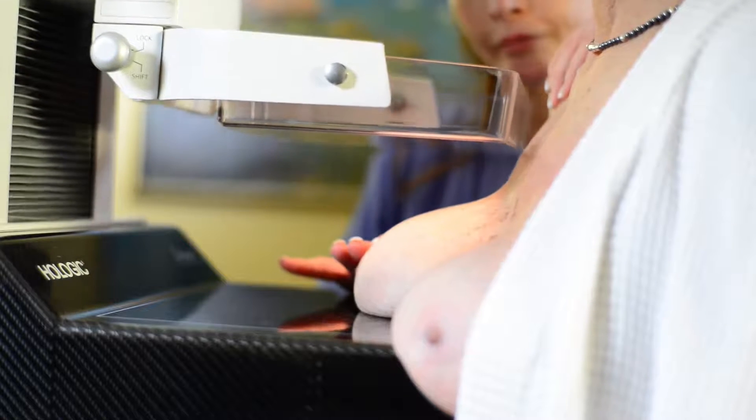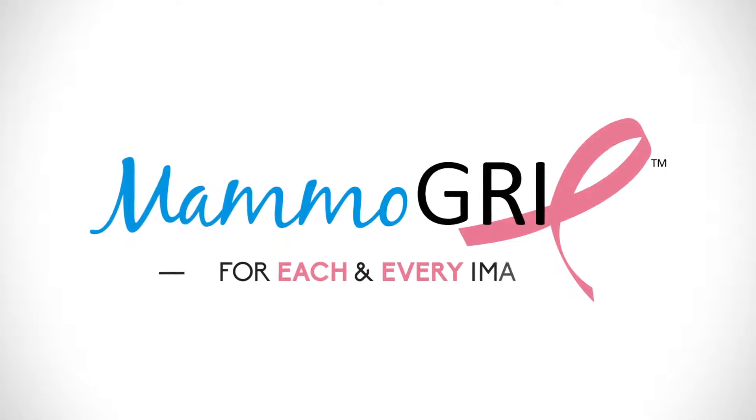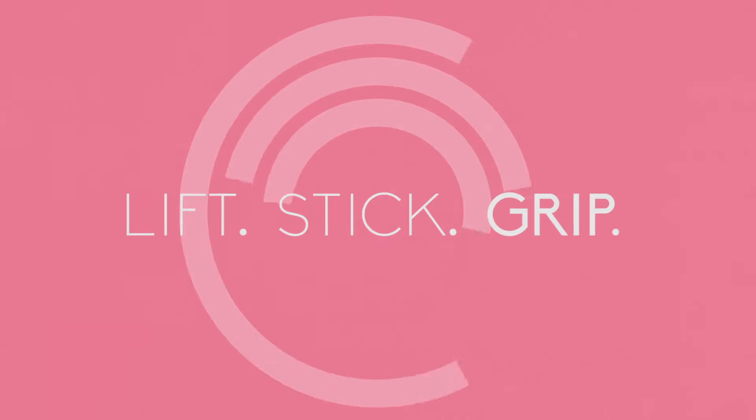Next, take the exposure as usual. Do this for each and every image — that's four per patient. Remember: Lift, Stick, Grip. Now with Mammogrip.